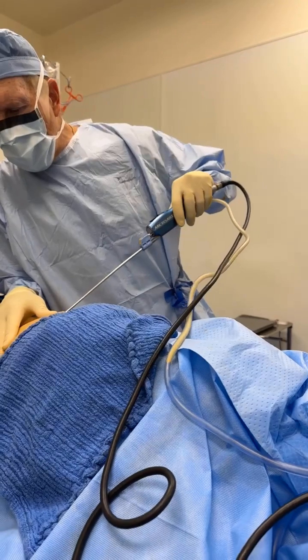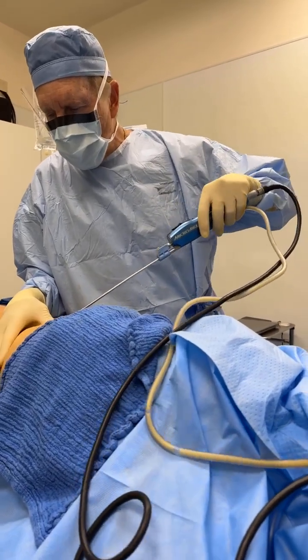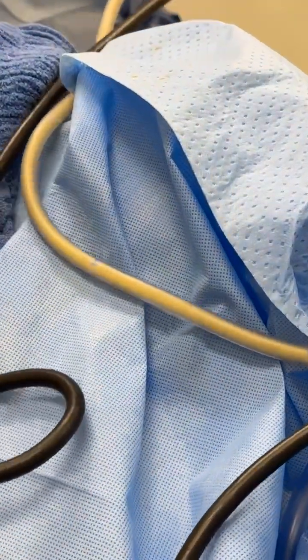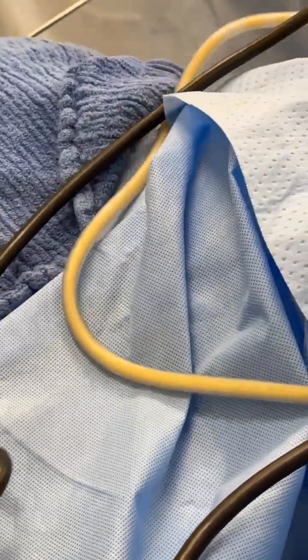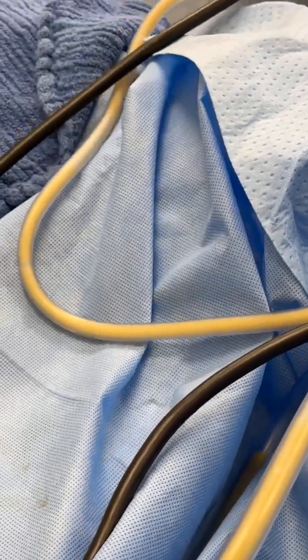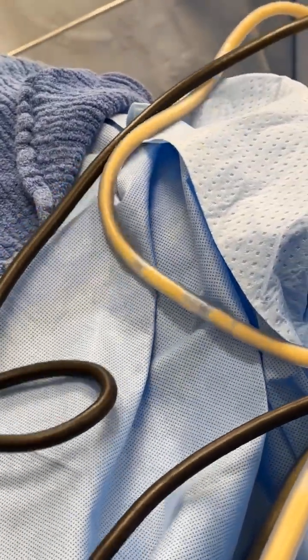It's actually very good — I think any surgeon can do this very safely even if they're not ambidextrous, because the way I do this is so soft, so controlled. I think this not only protects the patient from internal organ injury, which I believe happens to the surgeon going at full speed — at the end of the day, fatigue perhaps after doing many cases on a Friday afternoon — and they lose situational awareness, like when you're flying a plane and you get lost.